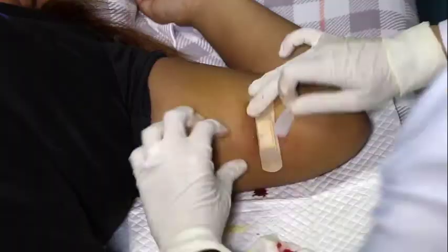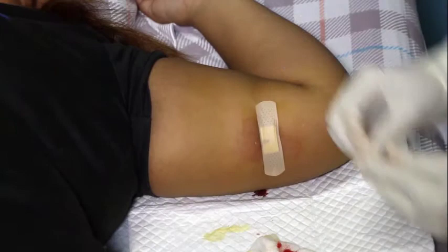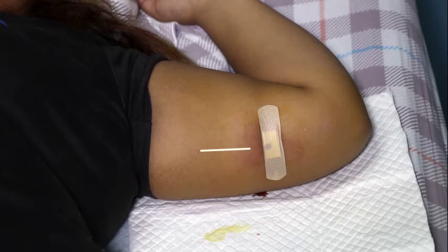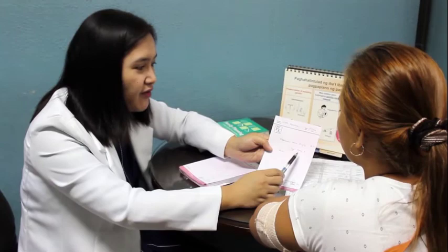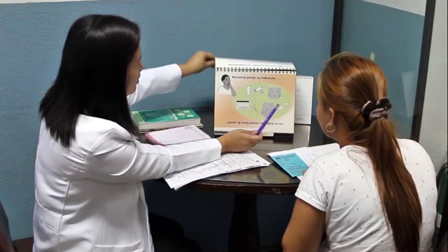If the client would like to have another implant inserted, choose an insertion site on the other arm or at least 2 to 3 cm higher up on the same arm to avoid another deep insertion along the same insertion tract. Tell the patient to keep her arm clean and dry with the dressing on for 24 to 48 hours. Discuss warning signs of infection such as excessive pain and heat. If the client would like to continue using contraception, counsel her on selecting another family planning method. Inform her that her return to fertility is immediate and to use another method as soon as possible.